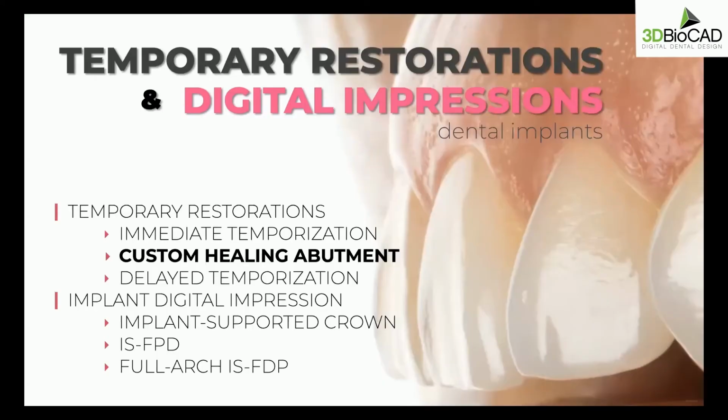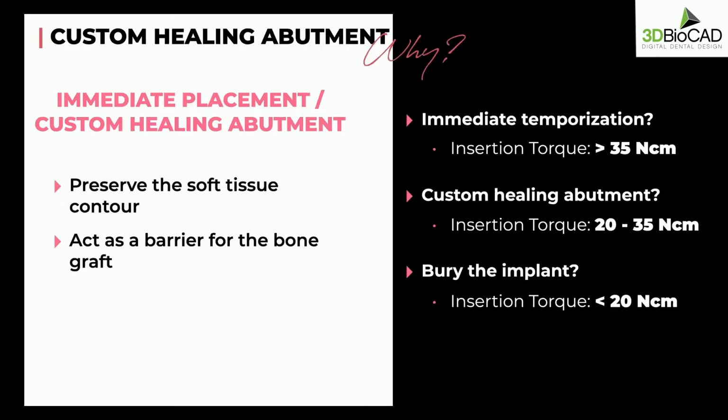The next thing that I'll go over is custom healing abutments. So why do we do custom healing abutments? It has the same added benefit as doing an immediate temporary crown after immediate implant placement. You preserve the soft tissue contour, and it acts as a barrier for the bone graft material.